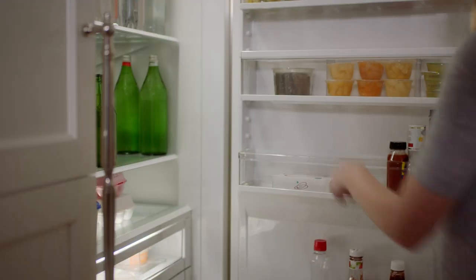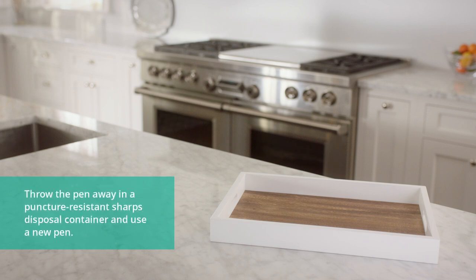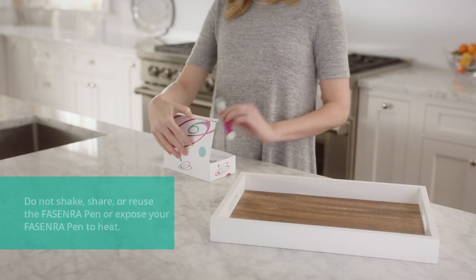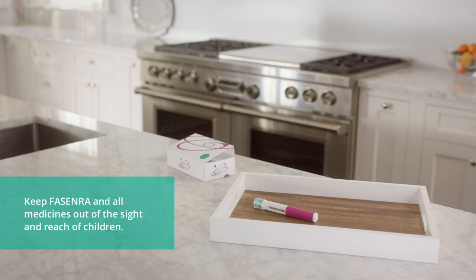First, take the Fasenra pen out of the refrigerator. If it has been frozen, dropped, or damaged, if the seal in the package has been broken, or if the expiration date has passed, throw it away in an approved sharps disposal container. Remove it from the box, just being careful not to shake the pen, and set it on a flat surface.